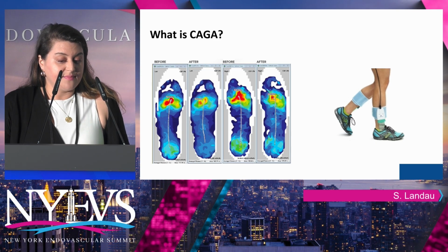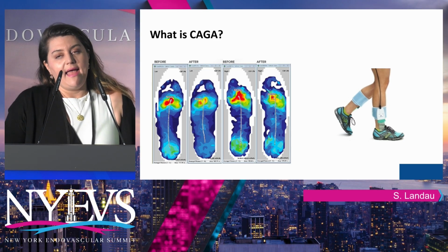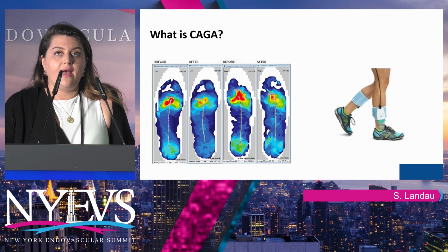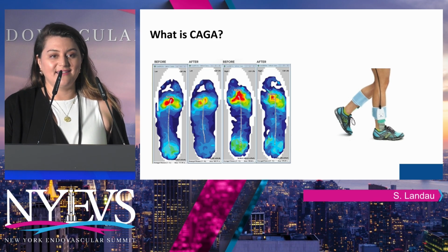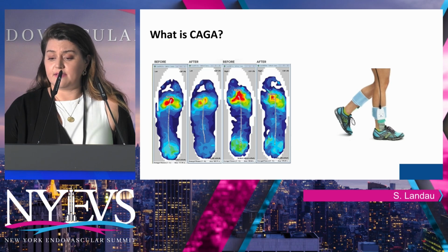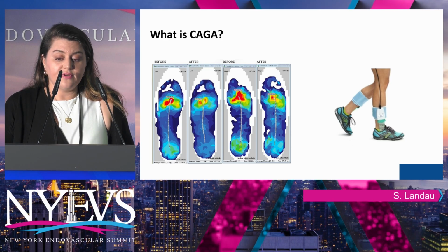When I spent time at HSS, they use one where the tile has the sensors in it, and even though there is useful data in that, it's very similar to a mat, just much more expensive, and the patient has to land a specific way on that tile. The whole foot has to be in it, whereas this one, the sensor gets trimmed down and placed into the shoe.